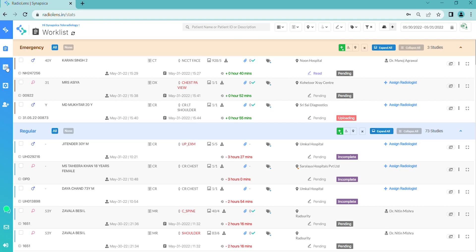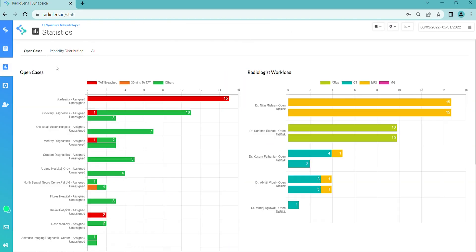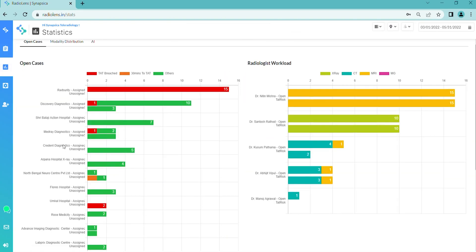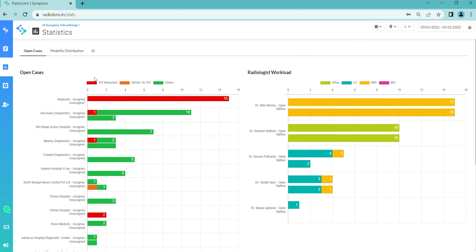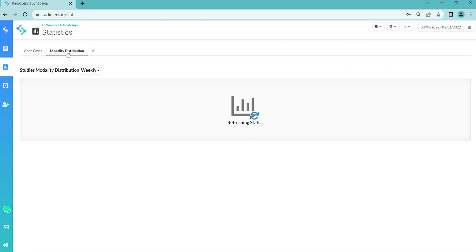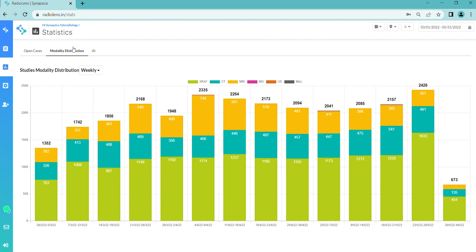For business owners, Radiolens offers a business analytics module to track overall cases and check the status of the cases, workload on radiologists, and study modality distribution to have cases distributed evenly for improved efficiency.